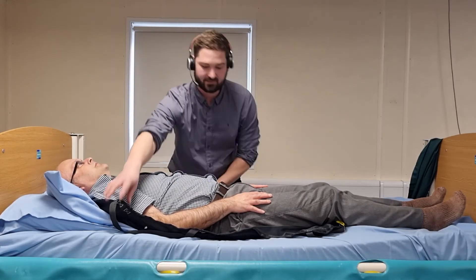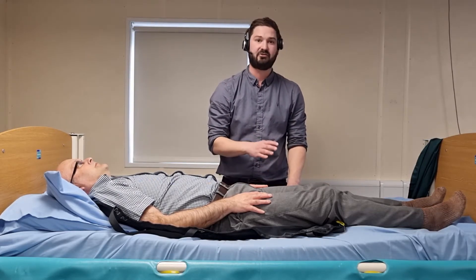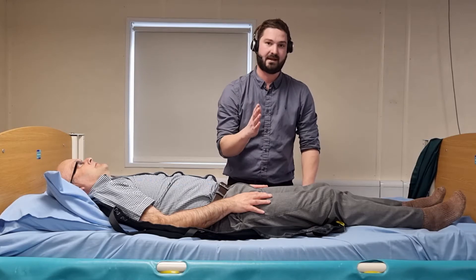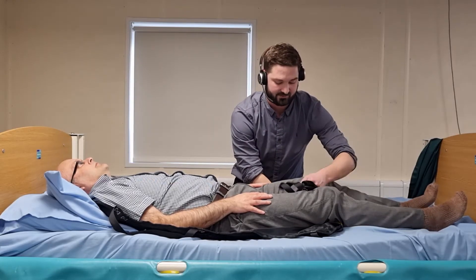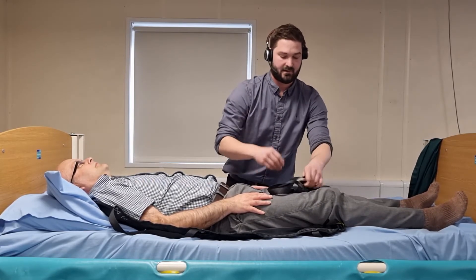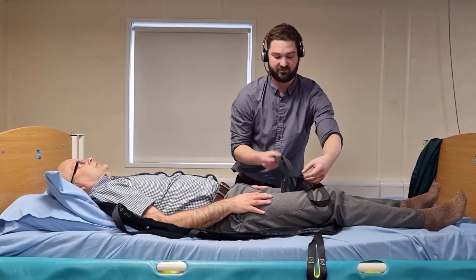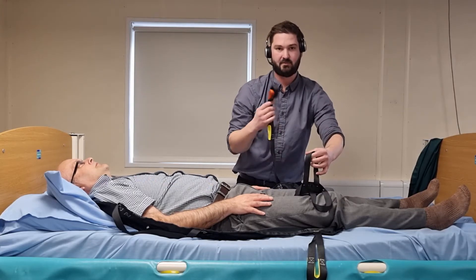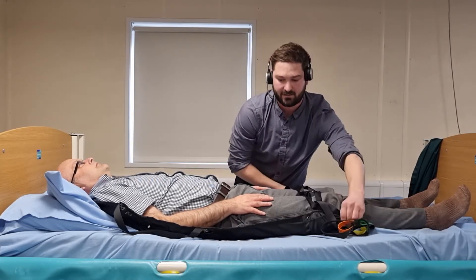Once you're happy that the sling is in a good position, look to fit the leg pieces. While fitting the leg pieces, you need to be aware of shear friction forces on the person's body. To reduce the risk of this, I'm going to place one flat hand between the sling and my person's leg to create a barrier and reduce the risk of any shear friction. I can then ease the sling through and get it fitted underneath him. This is a divided leg sling, so I'm going to loop the middle straps together, then bring the outside straps through. That's the lower part of the sling fitted.